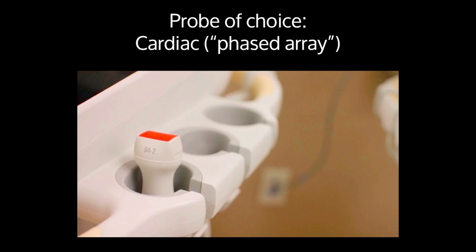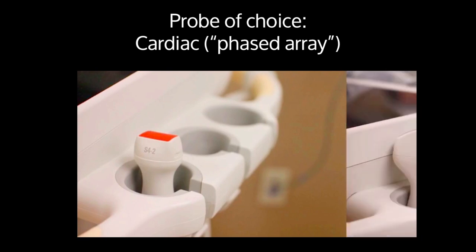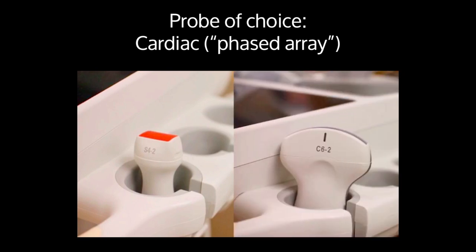This probe is great for fitting in between the rib spaces. If your machine does not have this probe, the curvilinear probe can be used, but really the preferred probe is the phased array probe. First, we need to talk about probe positioning.